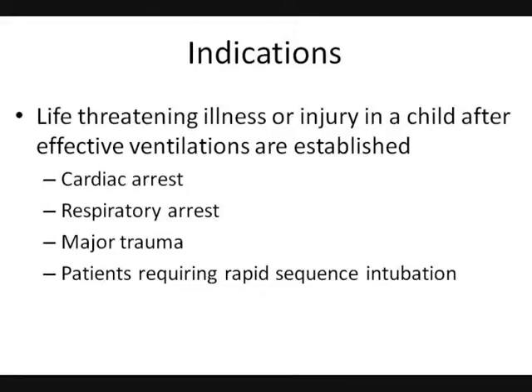Hi, it's me again, Tom McLean, and we're going to do a quick demonstration with a little bit of information about how to use the EZ-IO. And the first thing I thought we ought to talk about were the particular indications for the use of the EZ-IO in the pediatric patient. And those indications are life-threatening illness or injury in a child after effective ventilations have been established.